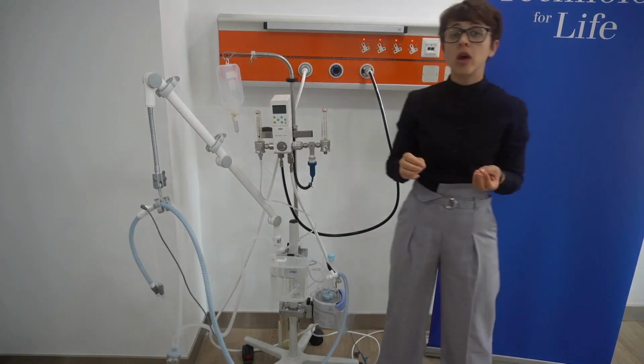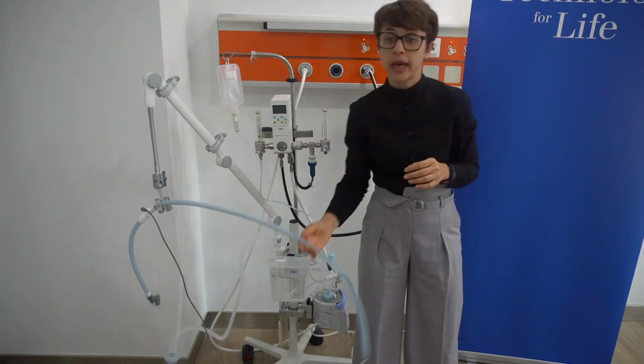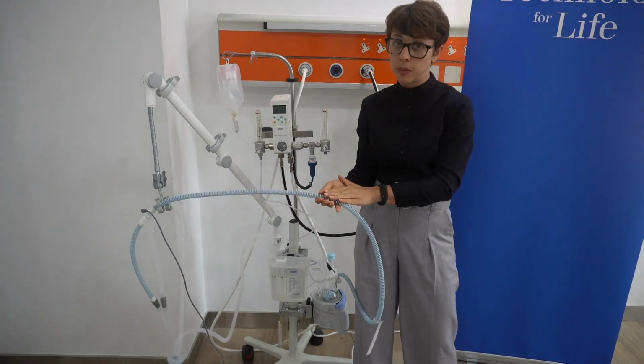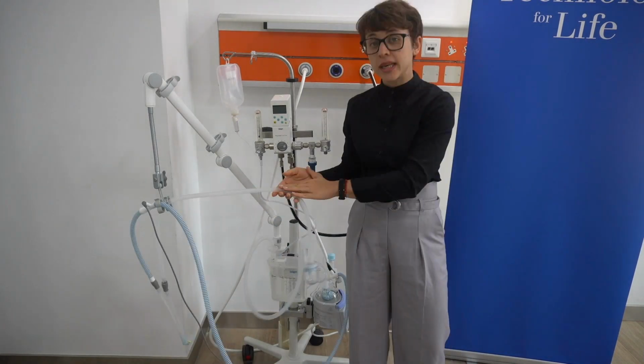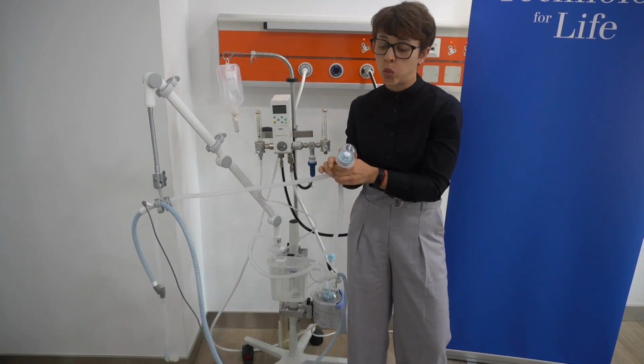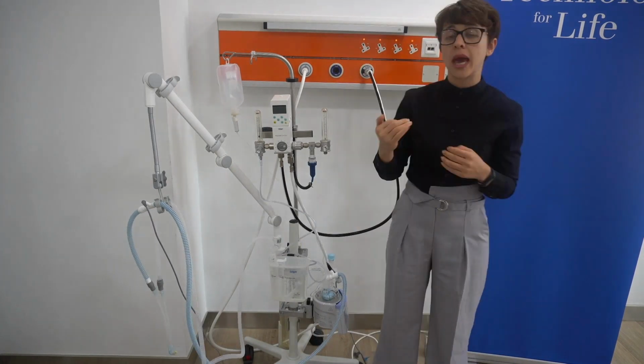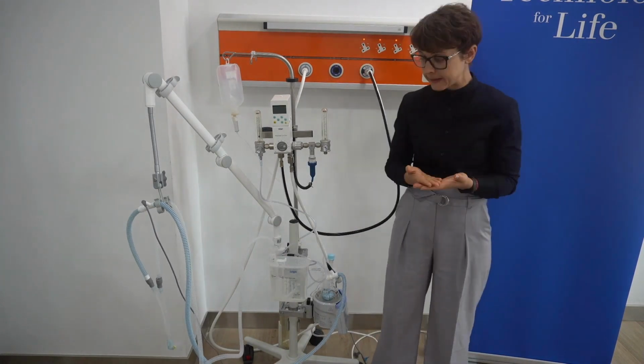We also have the possibility to have a dual heated circuit. So we will have the inspiratory heated and expiratory heated, and in that case you would not need the water trap because the condensation will be reduced by having the heated expiratory circuits.